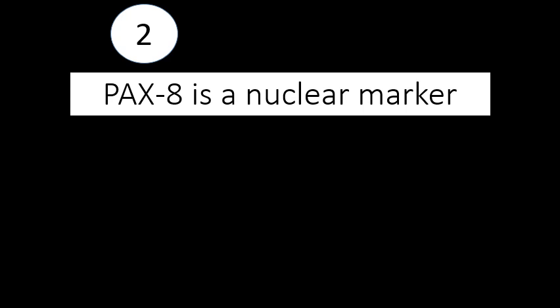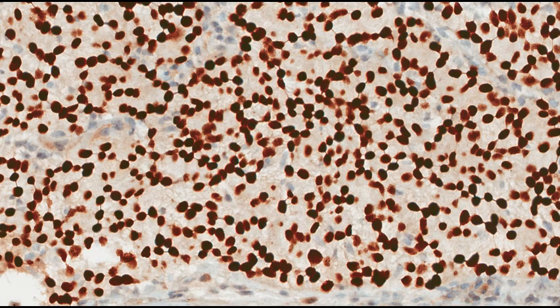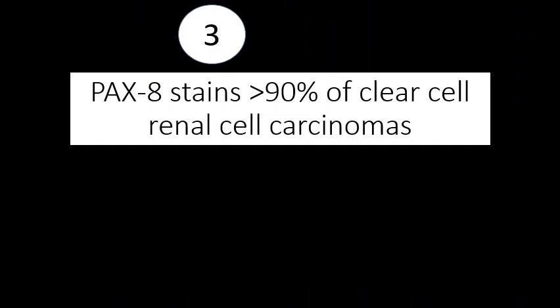The same is true for PAX-8 — PAX-8 is a nuclear marker. It should look like this: all the tumor cells are positive, but positive only in the nuclei; the cytoplasm is negative.